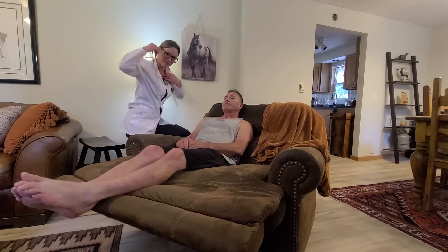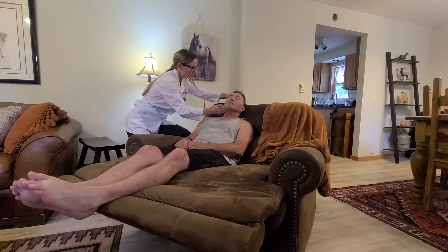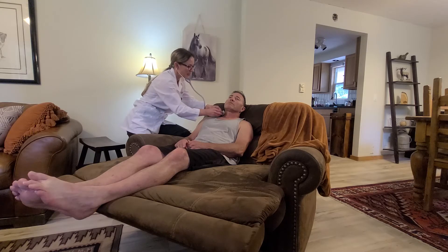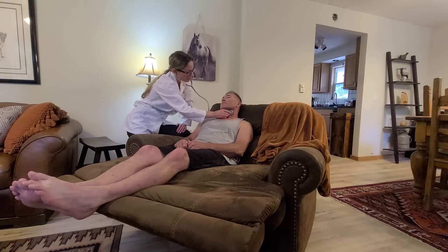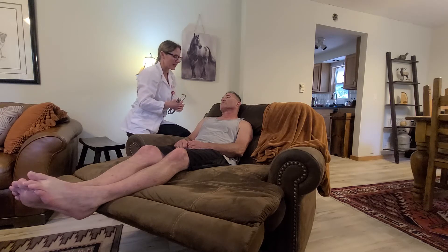Now I'm going to auscultate the carotid with the diaphragm and the bell, turning his head just a little to the side. I have the diaphragm here, and then the bell. I'm not noticing any bruit or turbulence, and there is no delay. It is a regular rhythm and a rate in the 70s. Again, I'm auscultating here with the diaphragm and the bell — no bruit or turbulence. The rhythm is regular with a rate in the 70s. It is a nice, smooth, brisk sound, and that's a normal finding.